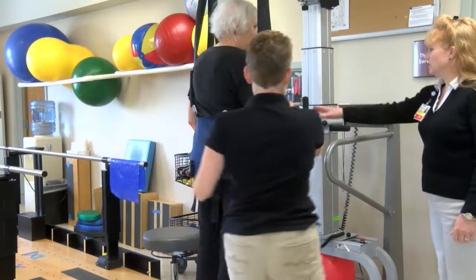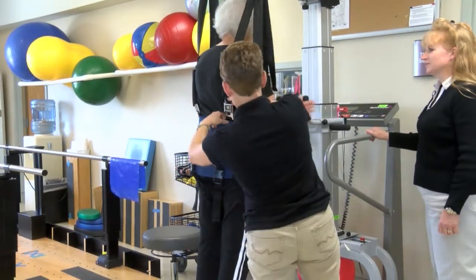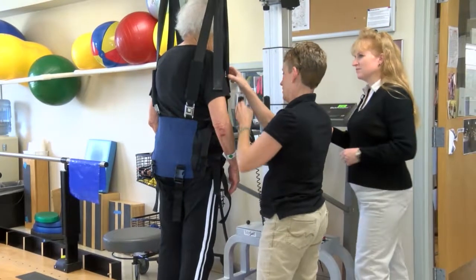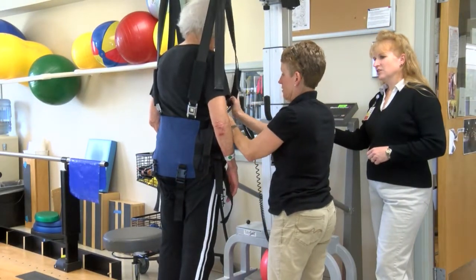It makes walking safer for them, and we can easily jump in and help to move one of their lower extremities if necessary.